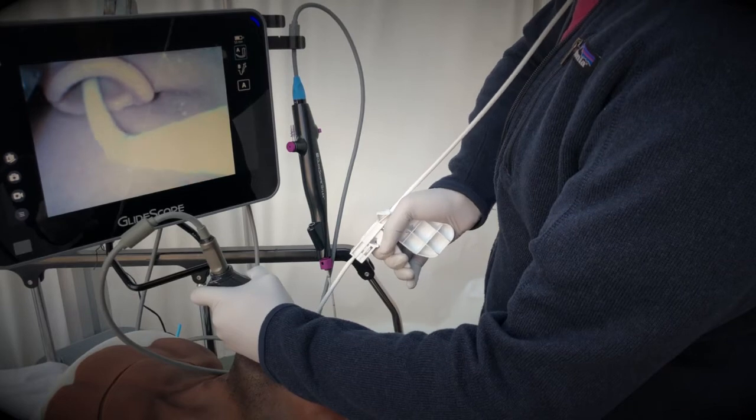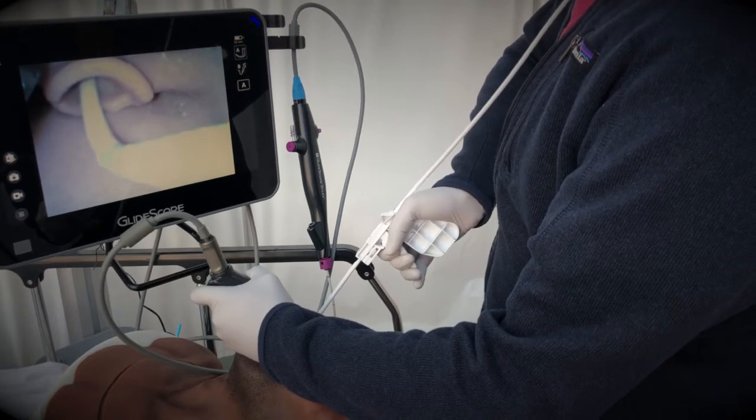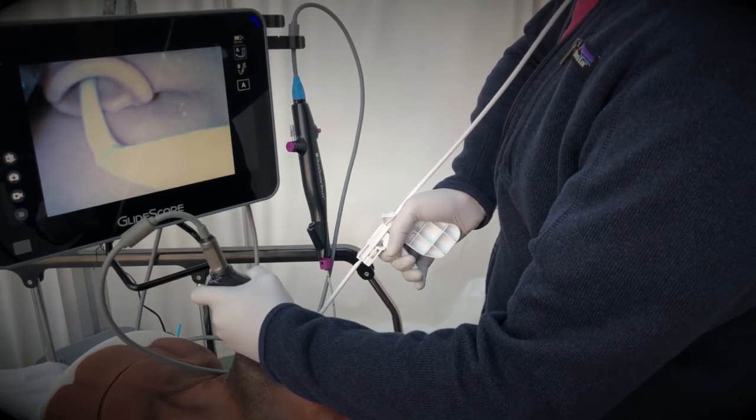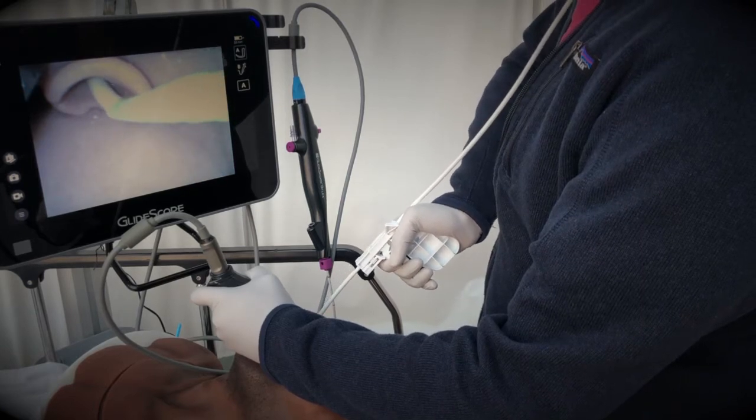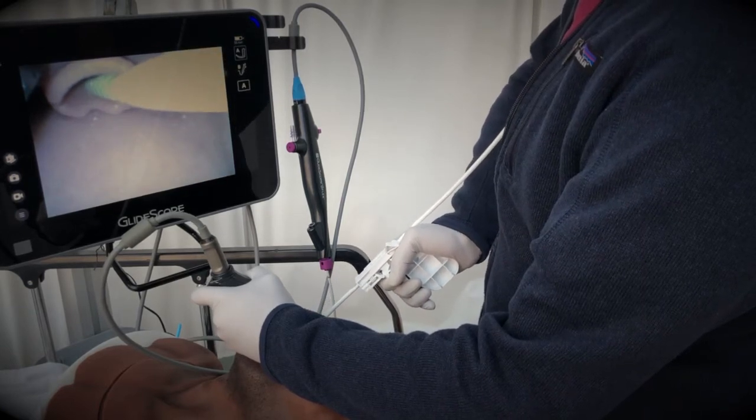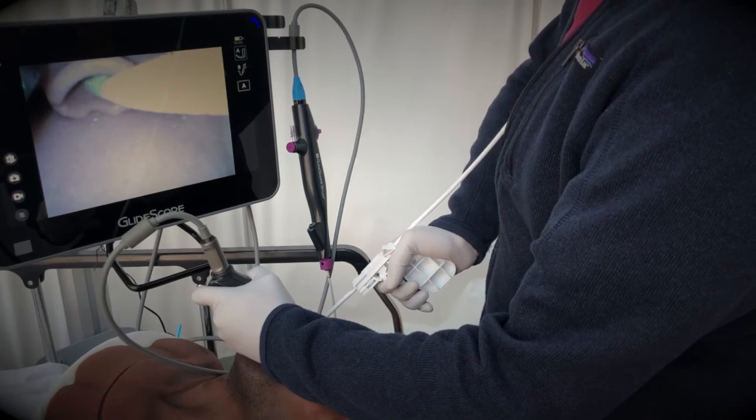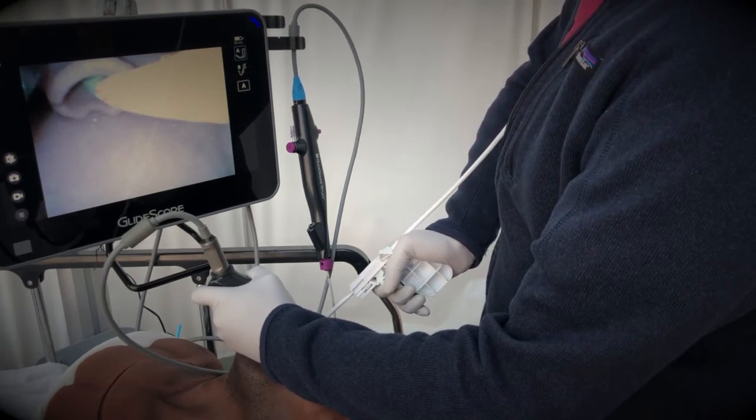And as you can see we're getting hung up on the tracheal rings, so we can troubleshoot this by squeezing the trigger straight out the tip and we're able to advance further to the green zone so we know we're at an okay depth.